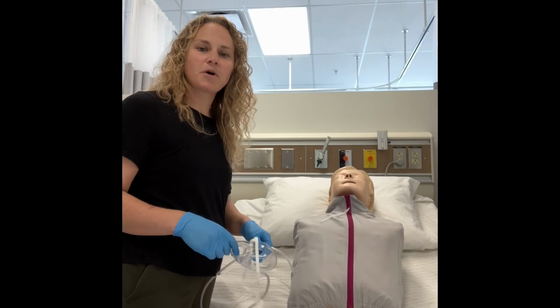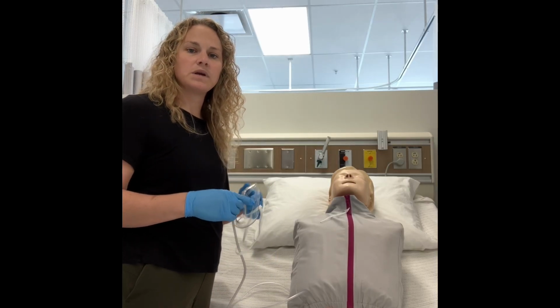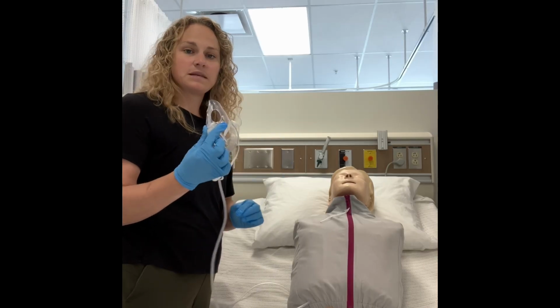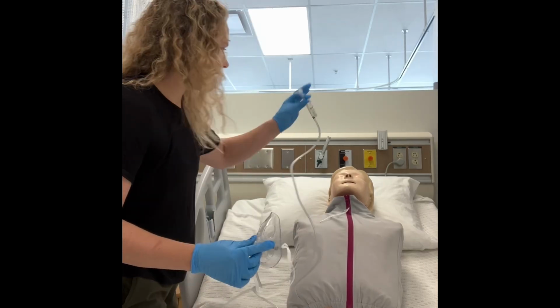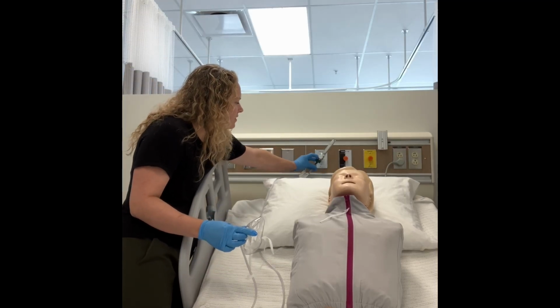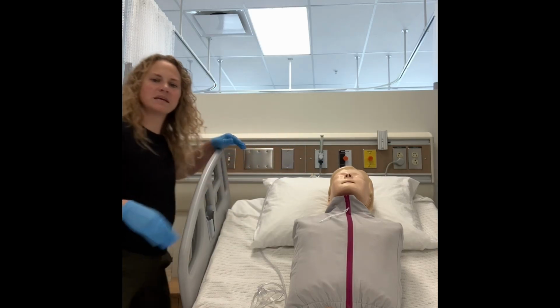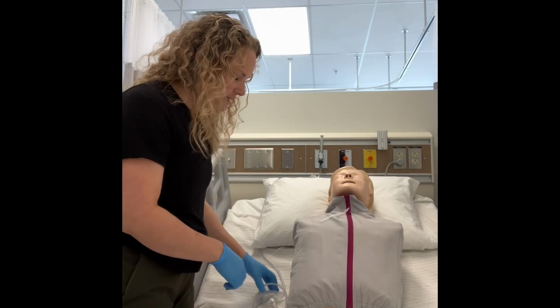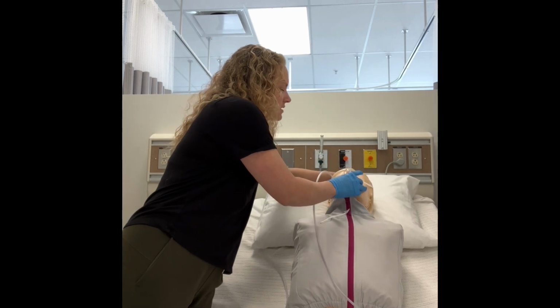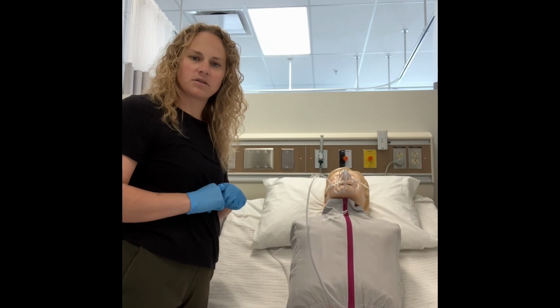The second type of oxygen delivery device that we can use for somebody who is breathing independently is a standard or simple oxygen mask. Again, our oxygen tubing connects to the flow meter, although in this situation, our flow rate will be 6 to 10 liters per minute. And then we use the mask as intended by placing it over top of our patient's head, like so.